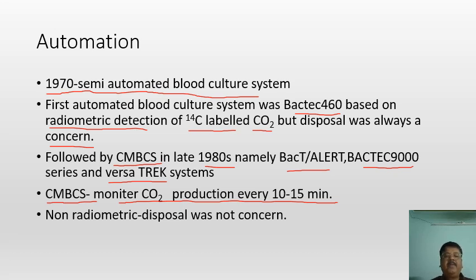It is non-radiometric, so it may use colorimetric or fluorometric mechanisms of detection. So the disposal of waste after testing was not a concern.